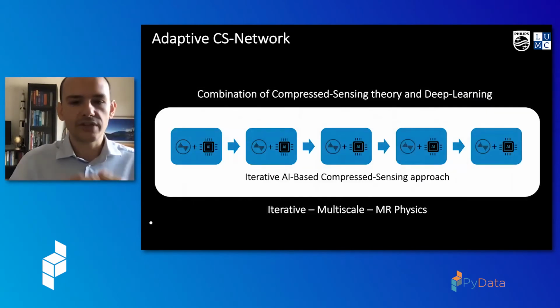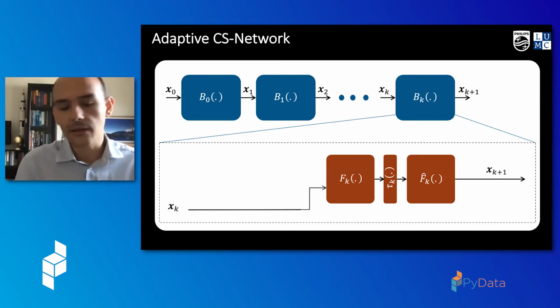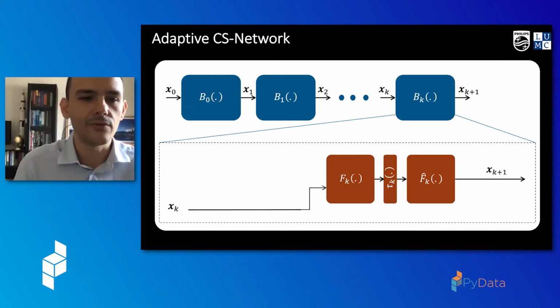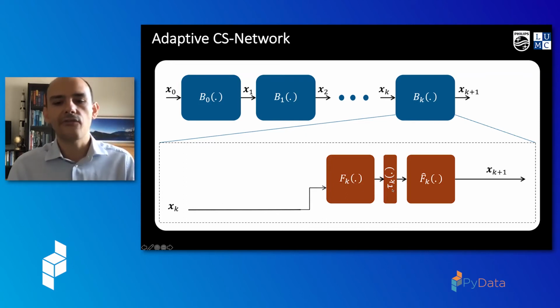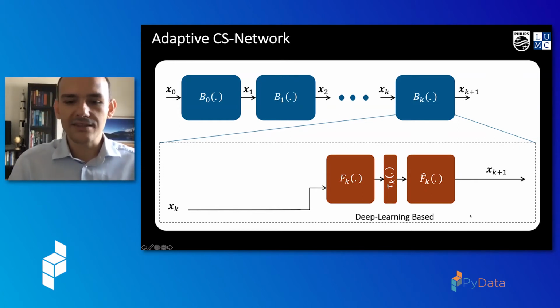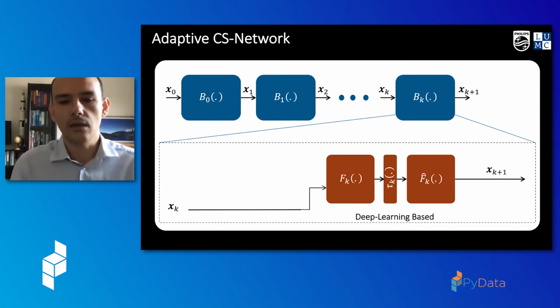What we did actually was combine the traditional approach, what I just showed, with AI. The way I think about deep learning, and I think it's a very powerful way to think about this kind of stuff, is that a deep learning model is nothing more than a functional approximation. And here you see our model, at least from a very bird's eye view. Our model is a composition of a number of deep learning blocks, and each one of these blocks looks like this. You have your X, in this case the image. You apply one function, the f that I said before, another function, the thresholding function, and the inversion of that function again.